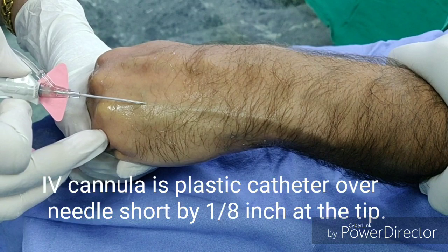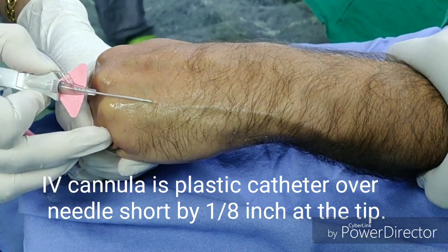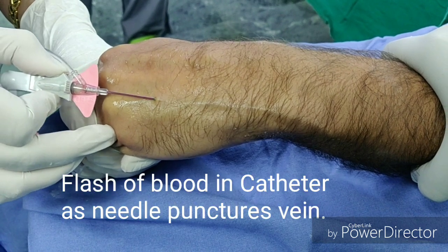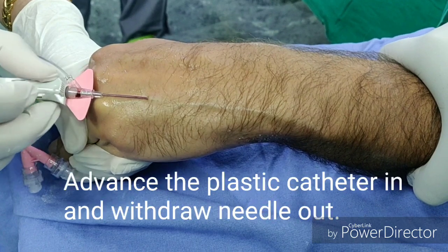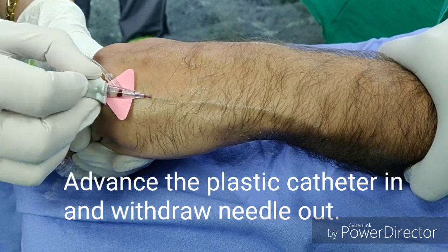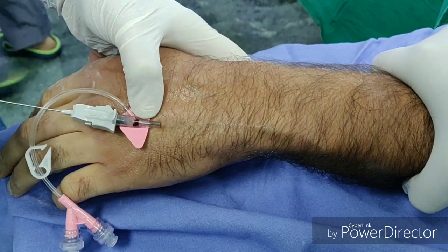Once the needle punctures the vein at an angle, a flash of blood is seen entering the hub of the cannula. Decrease the angle now to zero and advance the cannula a bit more into the vein, about a centimetre. Then hold the needle back and advance the plastic cannula into the vein completely.